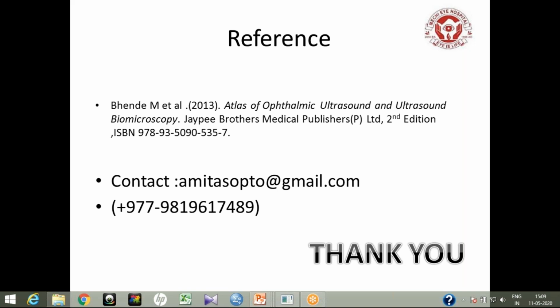Thank you, Kapil, for giving me the opportunity. So do B scan, start B scan. Nothing is impossible. You can do it, and you can see the different cases, and by doing B scan again, you will become familiar with lots of cases, and that will be very fruitful in your future.